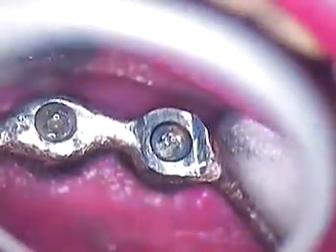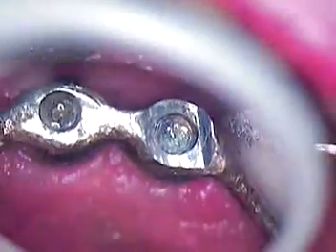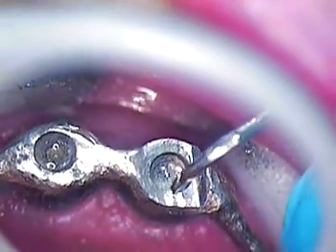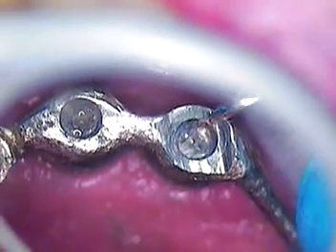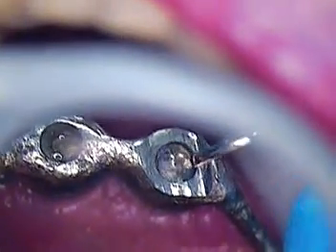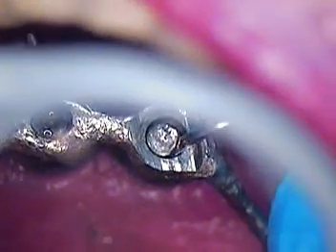All right. Good news. I'll just dry that now. All right. Now we'll move this way here. Let's just see. It does like to spin, but we'd like it to spin the other way. It's this way. So let's just see. There we go. There it comes. On its way out.